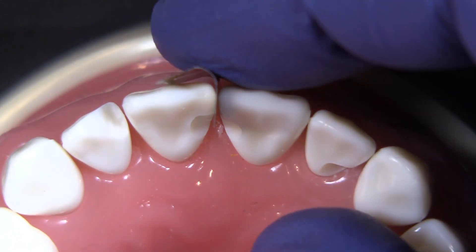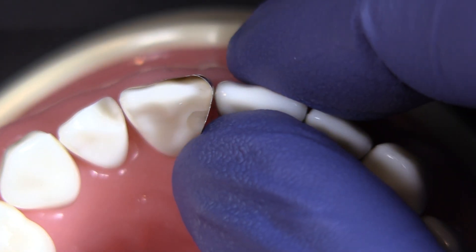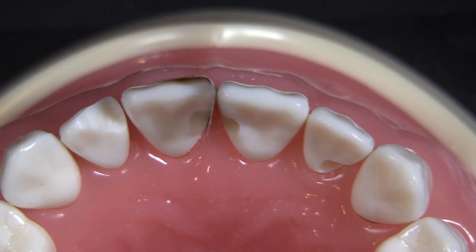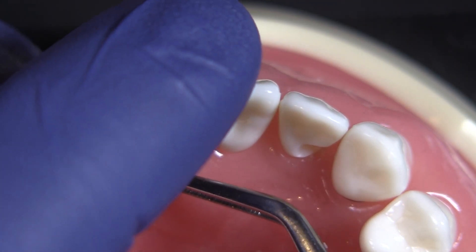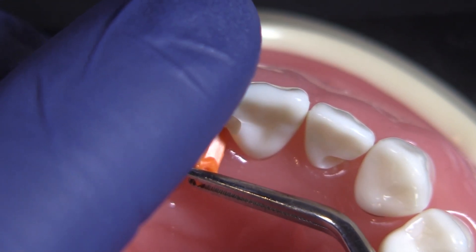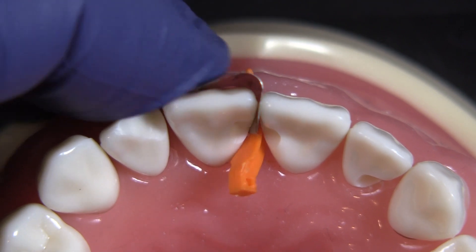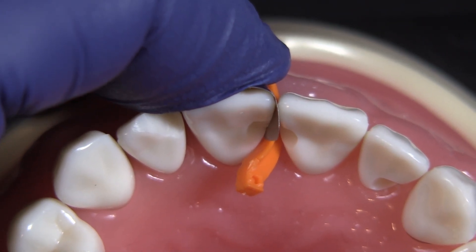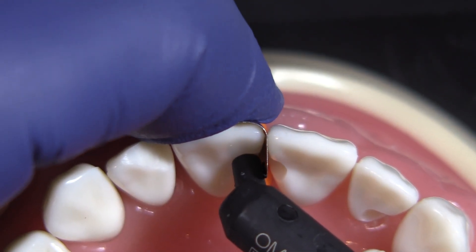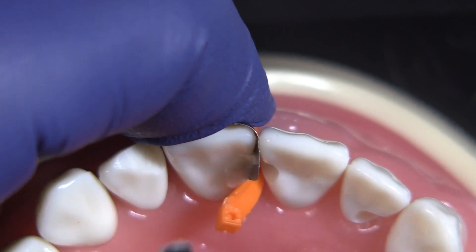So let's say that we're working on number eight here, and we're going to place that matrix band so you can see where that sits. Now, what we're going to do is put a wedge in there as well. And once that's set up, in this situation, we're going to apply some finger pressure here. Then what I'm going to do is add some composite right to that restoration — it's wide open and available. The access is fairly easy. You can see it's starting to ooze out there.